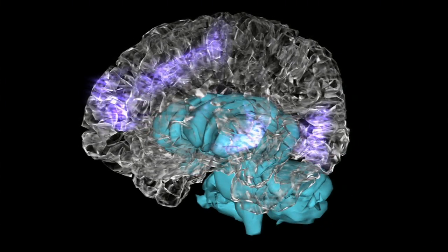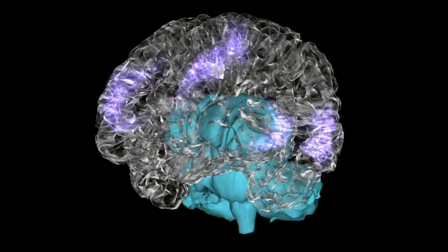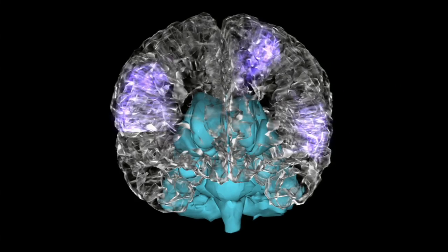Now what I'm doing is showing you theta rhythms. You can see they have a very strong frontal dominance. These are the rhythms that are associated with attention, concentration, working memory, and holding information in mind. We can view all these rhythms in real time. Right now it's a demonstration — the first of its kind that I know of in front of a live audience.